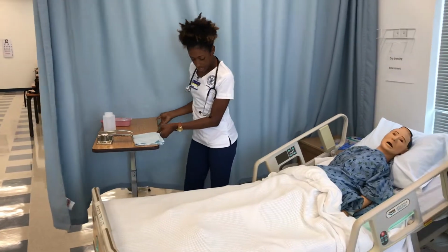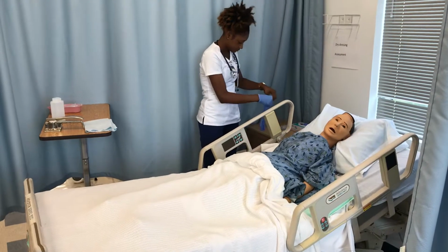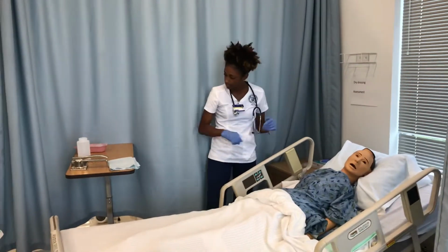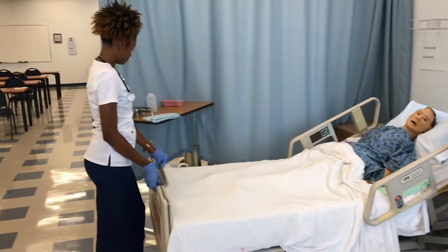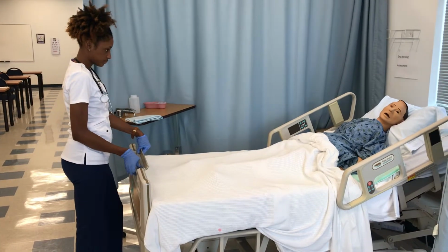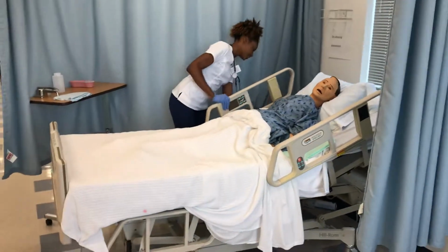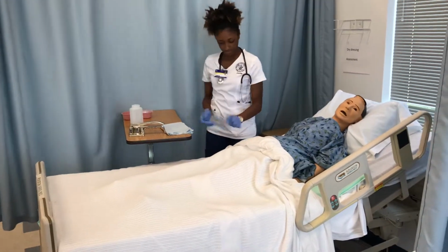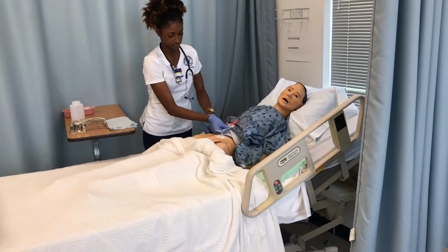Alrighty, Mr. Smith. I'm just going to raise your bed up, but first I'm going to put on my gloves. Okay. Okay, Mr. Smith, you're going to have to expose your abdomen. Okay.